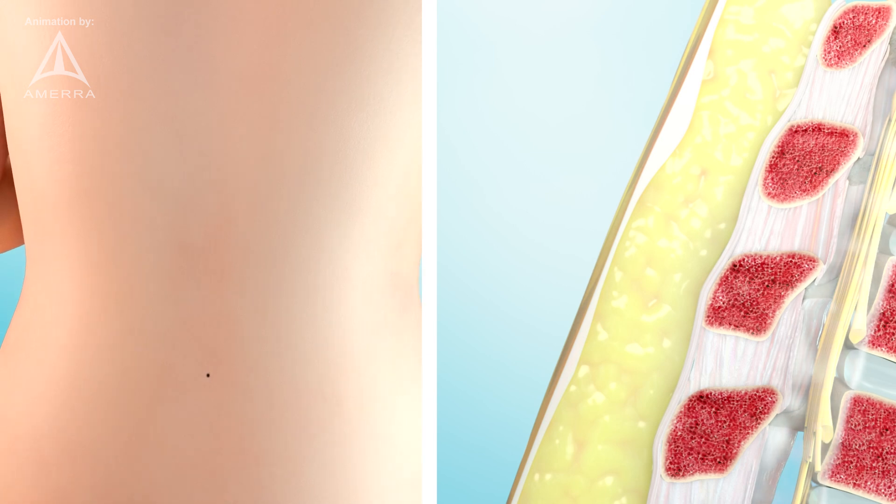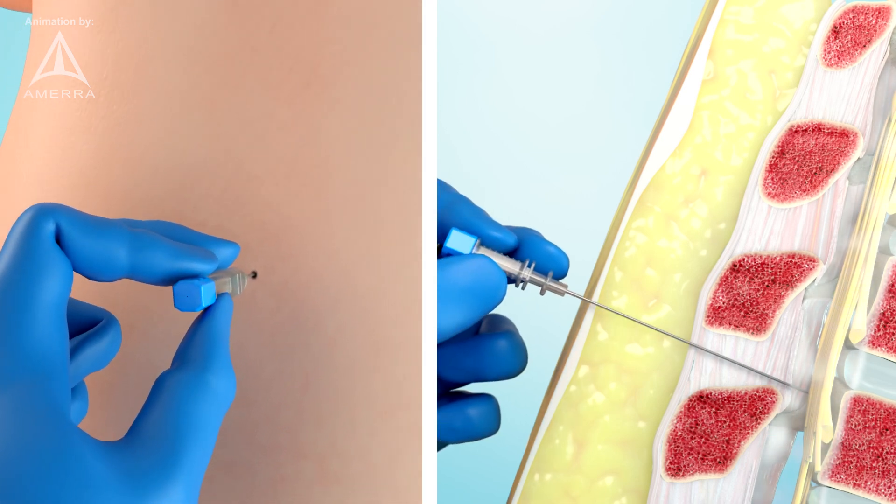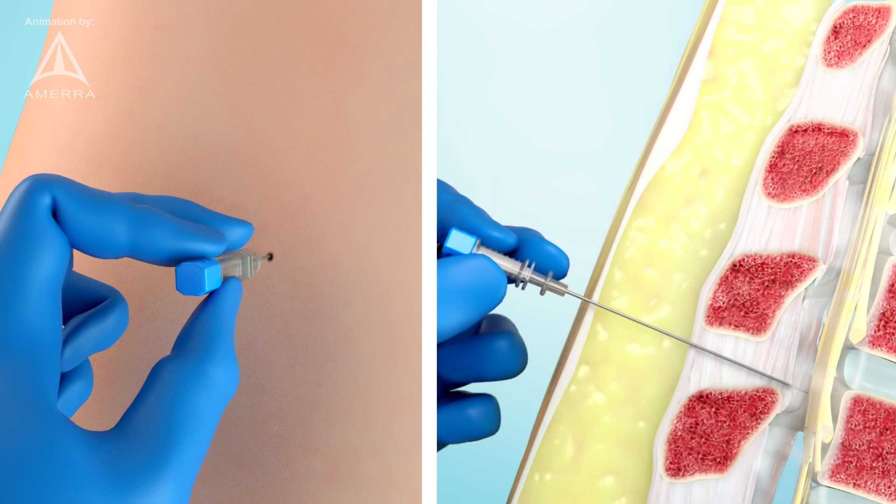Remove the device and complete the procedure per the standard of care. This includes injection of local anesthetic followed by injection of therapeutics or anesthetics, or collection of cerebrospinal fluid, not shown in this video.